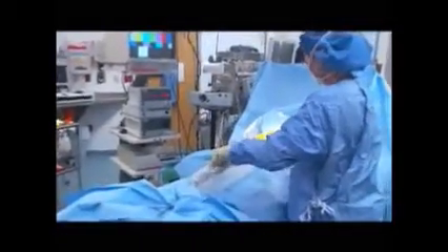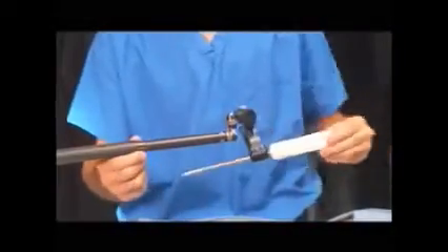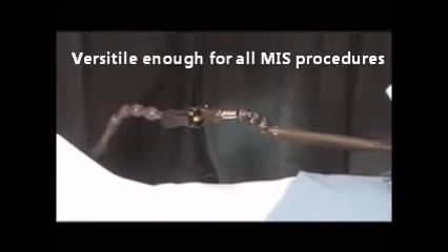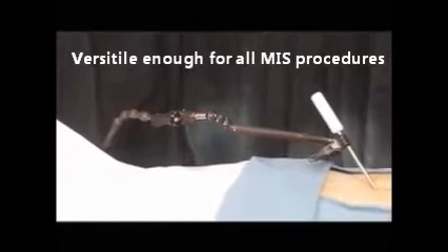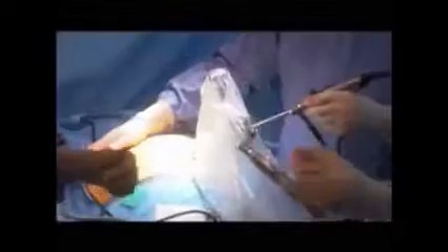The laparostat is easy to set up, may be quickly connected or disconnected, and features an unrestricted range of motion. Designed to contour close to the patient, the laparostat has a low profile for minimal impact on the surgical field and can be instantly folded out of the surgical field when desired.